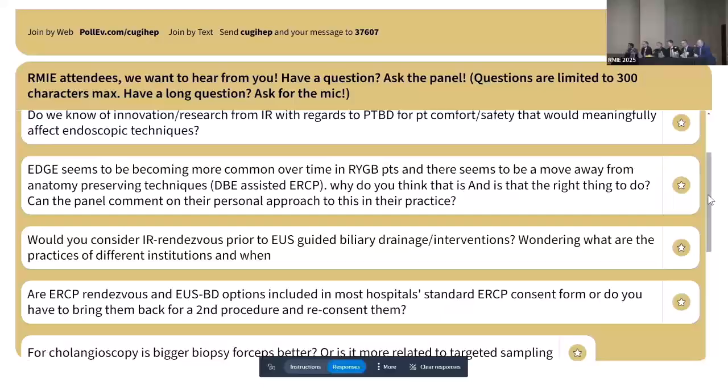And what has disappointed me about LAMS is that when you remove the LAMS, the tract almost always closes. And that was a huge disappointment, because my assumption was that if you leave the LAMS in place for a prolonged period of time, let's say 6 months, the fistula would stay open. And I've realized that's not the case. So that is a problem as you think about LAMS as a long-term solution. You've got the problem of overgrowth and ingrowth. We've heard about the bleeding complication. And if you remove the LAMS, then the fistula closes. The natural orifice pathways don't close.